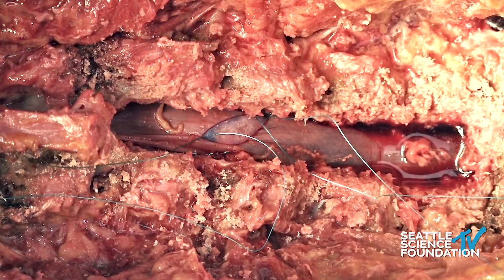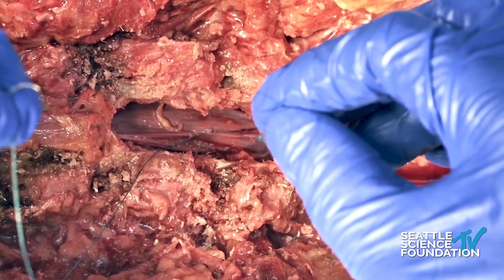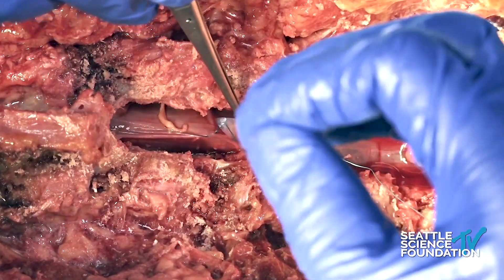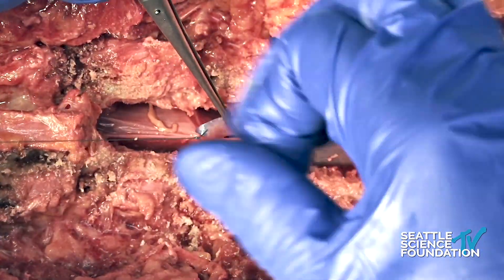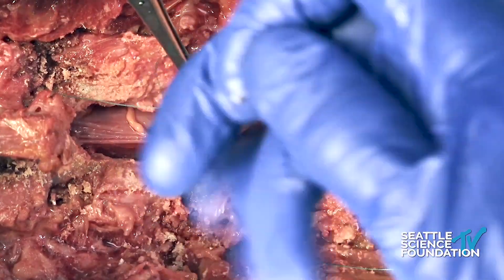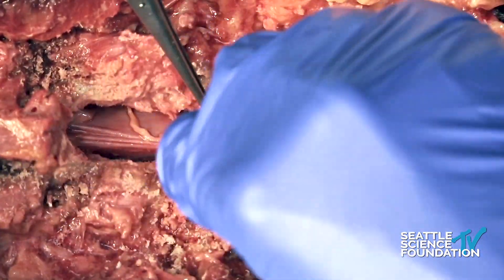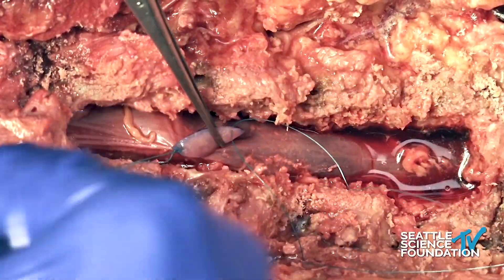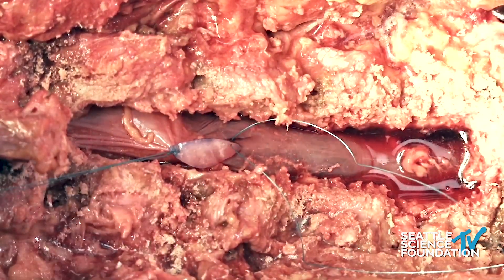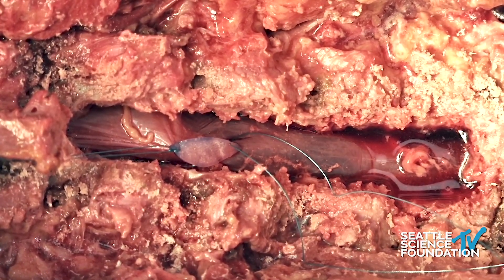Now I will tie. Garrick, if you can hold that dural patch down with a pickup. Do you use any specific pickups to not injure the dura more — are there favorite blunt pickups like jeweler pickups? That's a great question. In the OR we would use Castro pickups, which are very fine tip pickups and allow us to have good control over the dura. If there is concern for the native dura not having very good integrity, we will make sure that when we're suturing we have appropriate coverage of the stitch to dura that isn't as ragged.